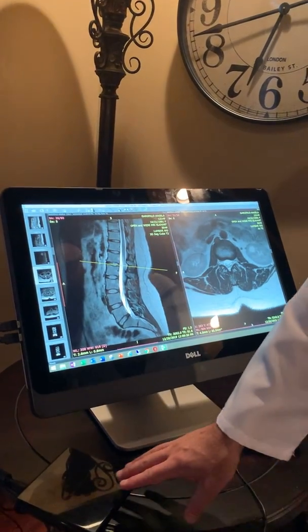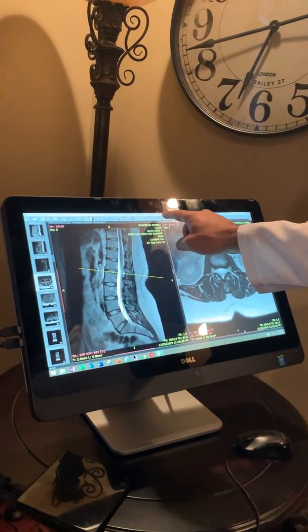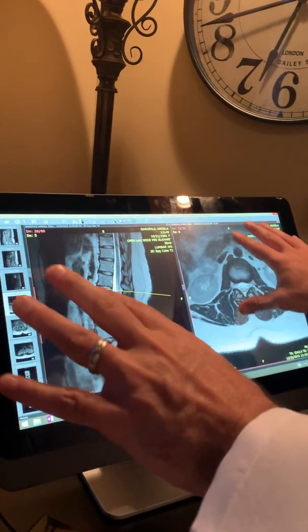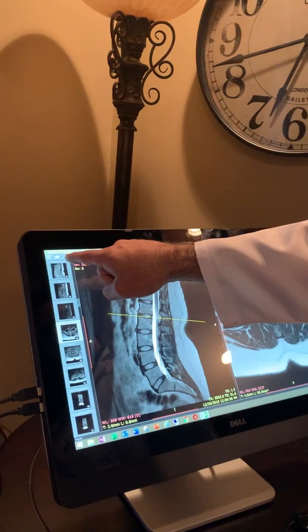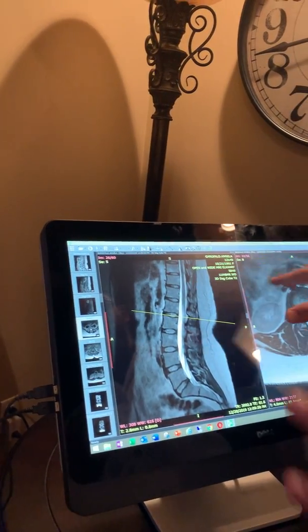First and foremost, we've got her CD here from the MRI company. We've downloaded radiantviewer.com, which is a phenomenal, easy way to look at MRIs. You click on it, it opens up, you put your CD into the computer, and then you hit that button right there which downloads the images. Then we separate our images — I like to look at two.